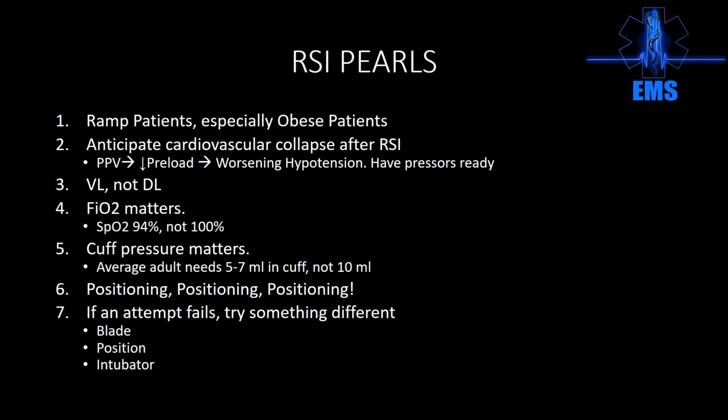This is all strategy. So try a different blade, try a different position. If need be, try a different intubator. There is no shame in missing an airway. There is shame in killing the patient because we just kept repeating the same thing over and over and over again. We've all missed airways. I have missed airways. I've had to have anesthesia, two behind me. Yeah, it's a little bit of embarrassment, but again, it's not about us. It's about the patient. Take care of the patient.